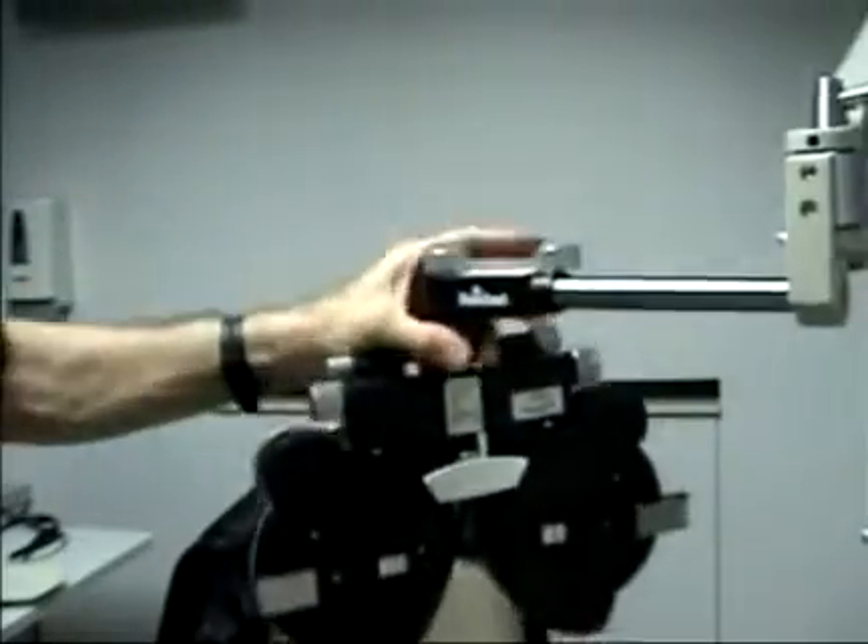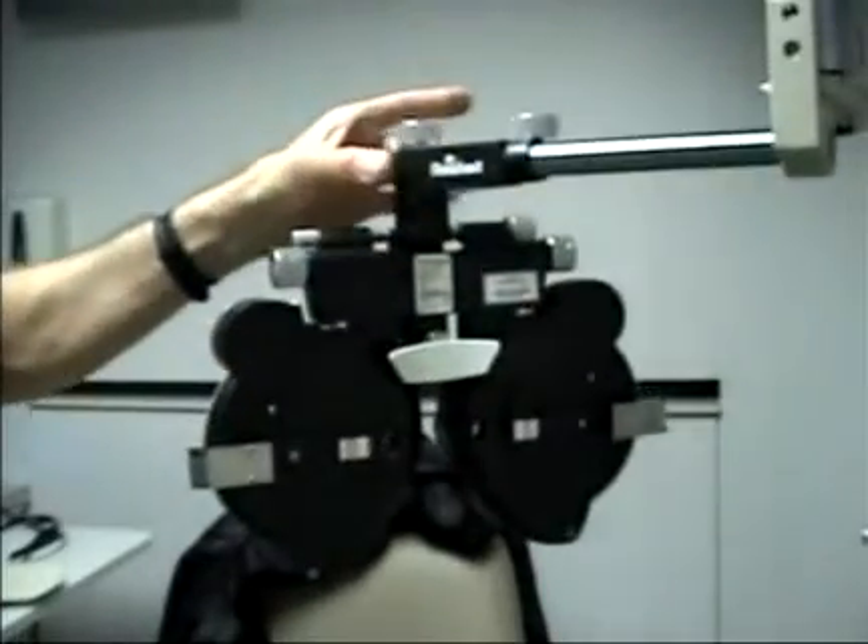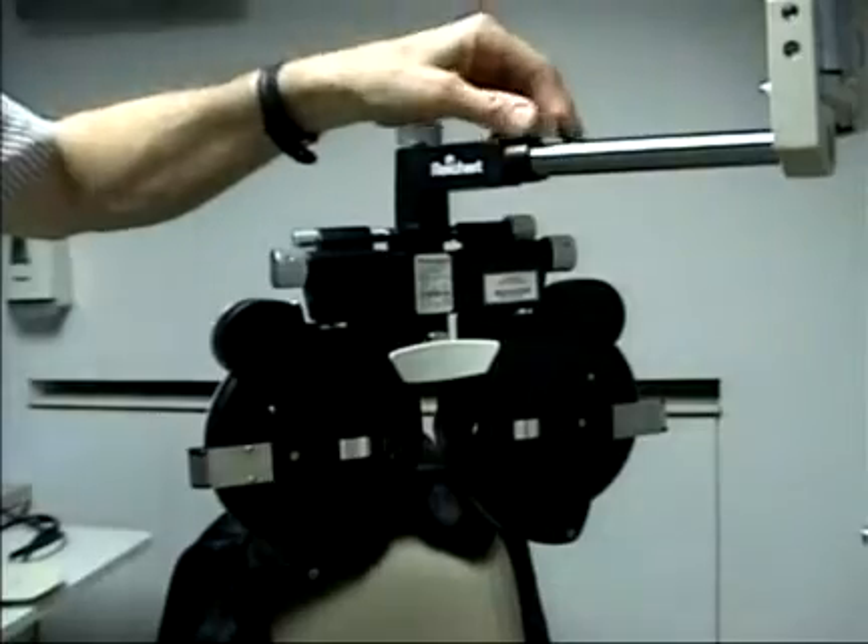This arm is fairly well counterbalanced now. It doesn't drop all the way to the bottom, it doesn't go all the way to the top — pretty well in the mid-range of its motion.